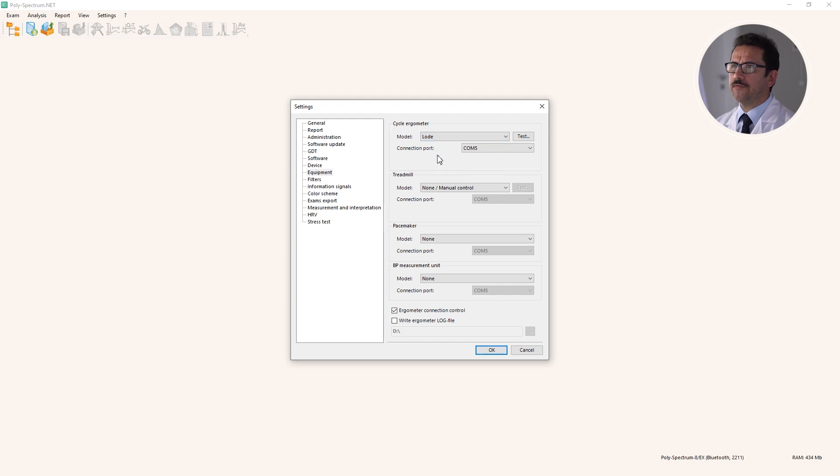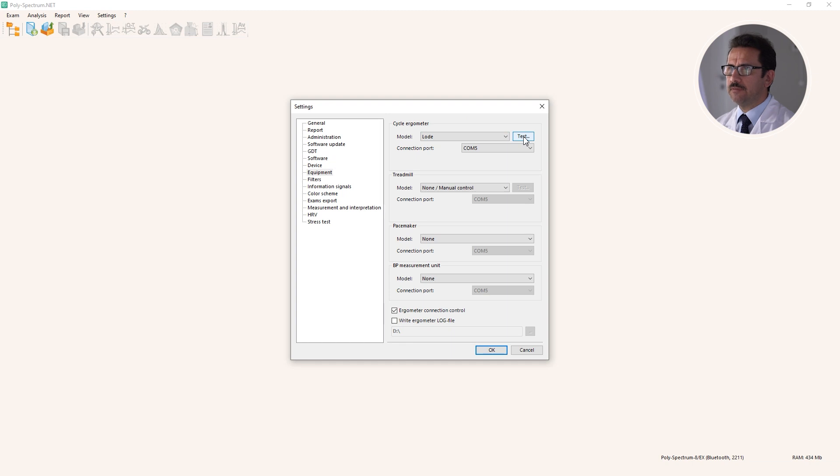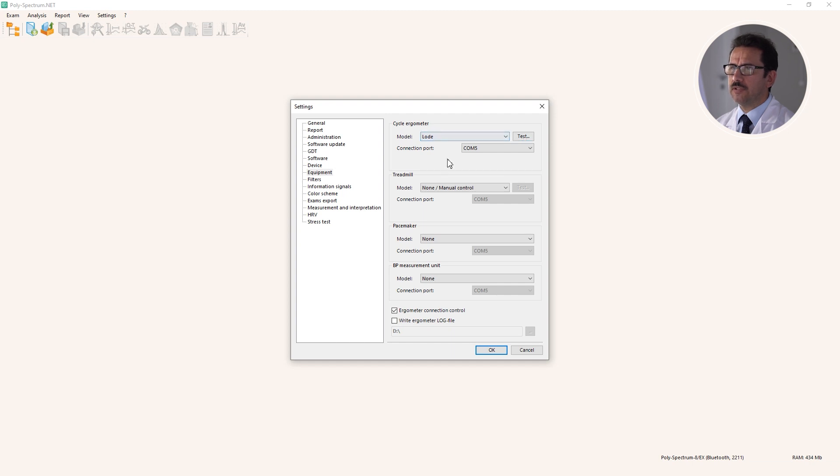If you have some doubts about the connectivity, you can press the test button and check if the connection between the exercise stress test device and the software is established successfully.